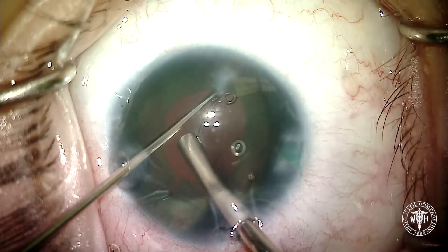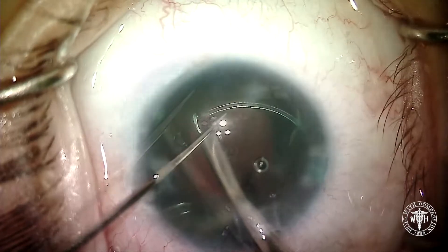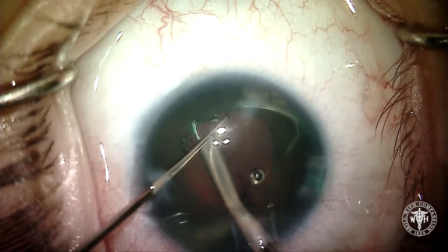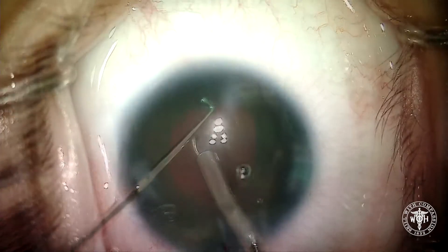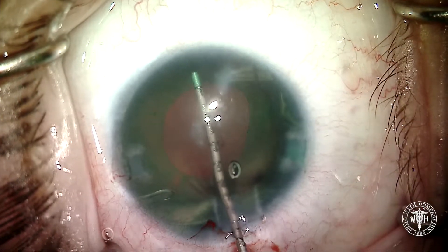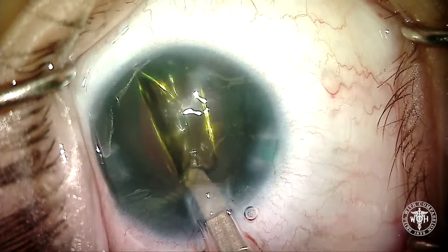Any patient getting an artificial iris, especially somebody with aniridia, is going to get a capsular tension ring (CTR). This will keep equal tension out on the capsular bag, help prevent chances of dislocation down the road, and help prevent phimosis of the capsular bag. In goes the CTR — we measure the capsular bag in this case at right around 10 millimeters.